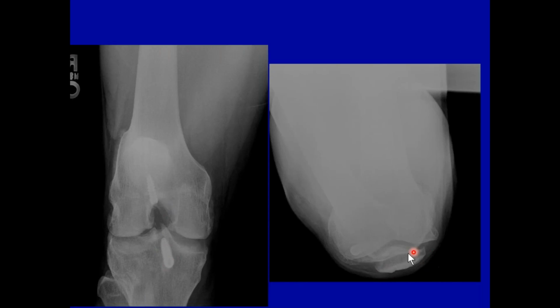And this is another scenario where they use a skyline view, because just because the tendon has been replaced or the ligament has been replaced, the anterior cruciate ligament, that doesn't mean that the joints can't undergo degenerative joint disease, especially if they're used an awful lot. And the best example that comes to mind is the football player tears his anterior cruciate ligament. He can't play professional football for a year because he's rehabbing, but after he's rehabbed and for whatever time, there are subsequent areas that become then involved.